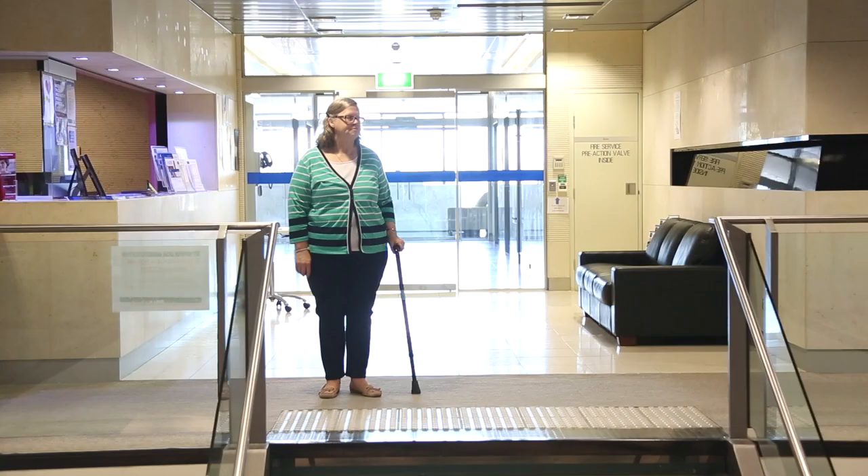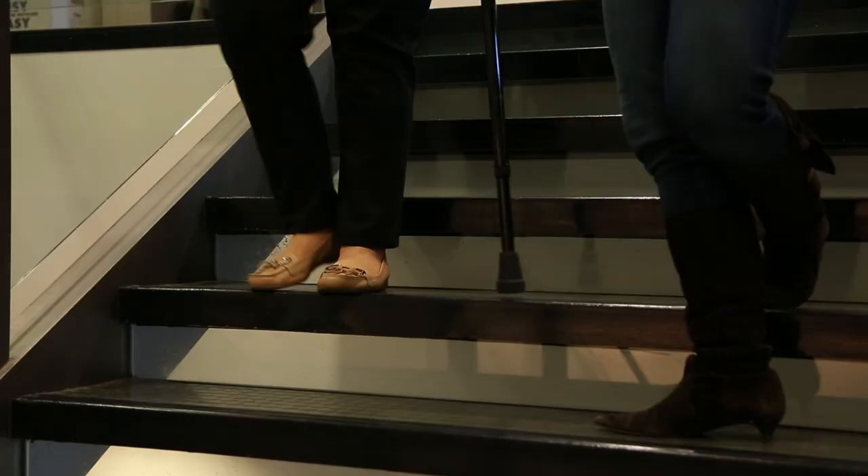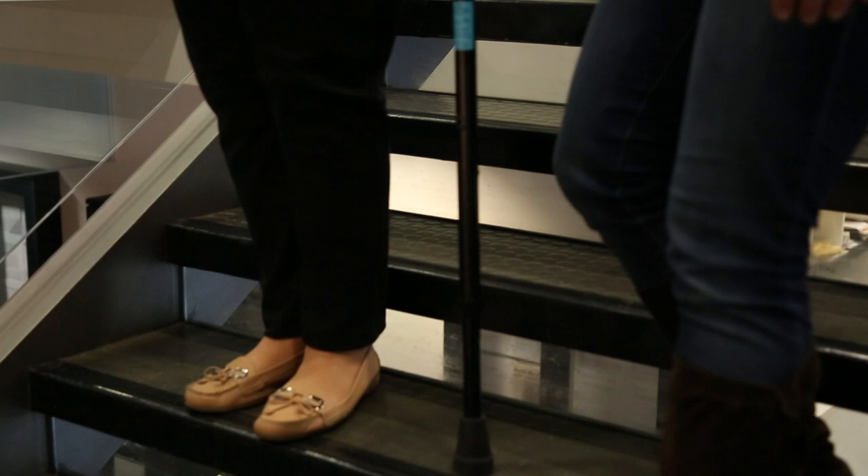Going up and down the stairs. If there is a handrail, you may want to use it for support. When going down the stairs, the technique is: stick, bad leg, good leg. When going up the stairs: good leg, bad leg, stick.